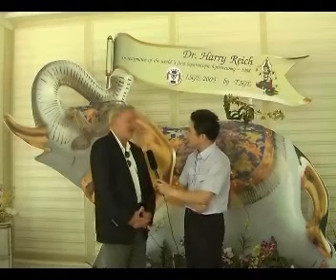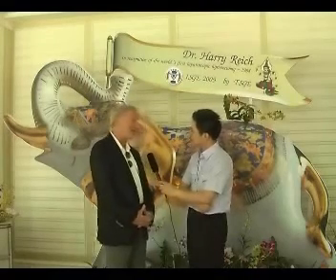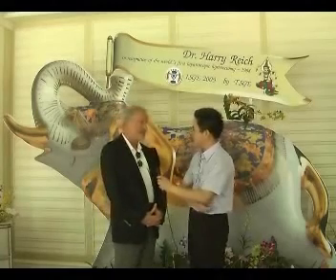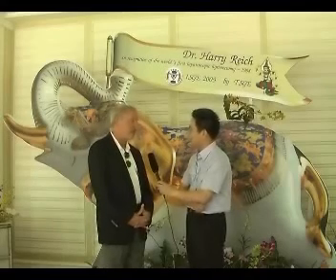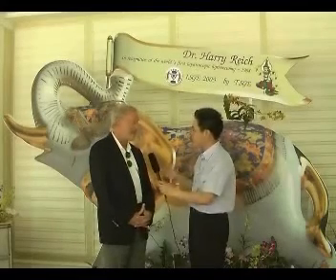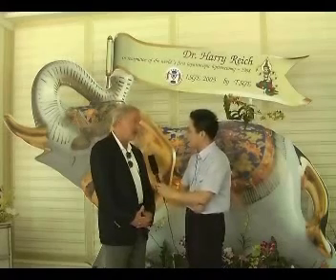In the 80s, I would do mainly vaginal hysterectomy, but if there was any problem vaginally, I used a laparoscope to confirm any injury. So at that time you just ruled out some complication of your hysterectomy. Yes. It's great if you think there's a problem with bleeding after a vaginal hysterectomy to look in with a laparoscope.